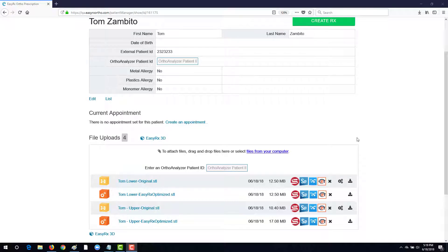Let's take a quick look at how easy it is to use EasyRx 3D. After uploading your files, EasyRx will auto-optimize the files to clean them in preparation for your editing.